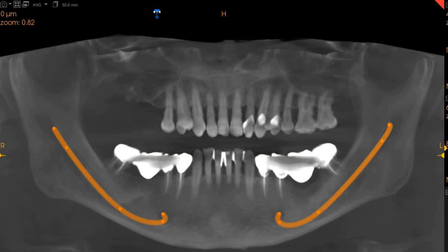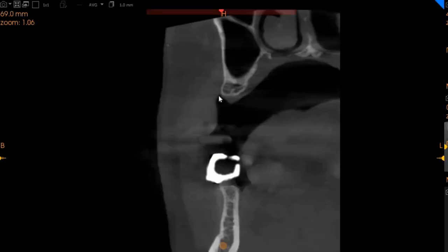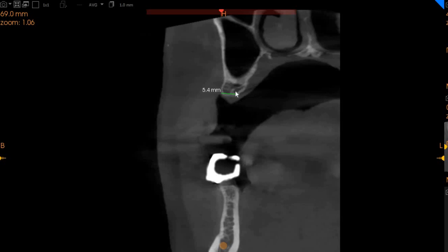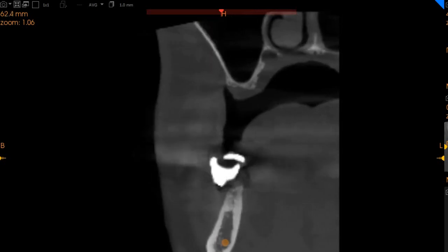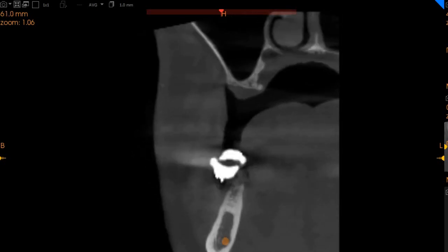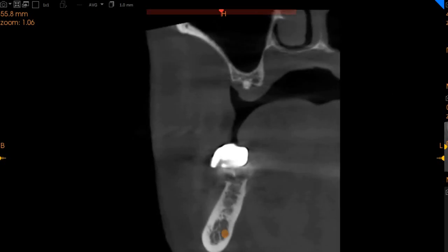The upper right six region, as you can see in the transverse view, has very little bone quality and quantity available here. We have approximately five millimeters of ridge width with only three millimeters of height. We have an extremely pneumatized sinus and no bone in the region of the six, and no bone in the region of the seven either.